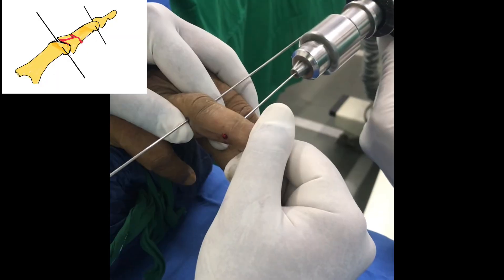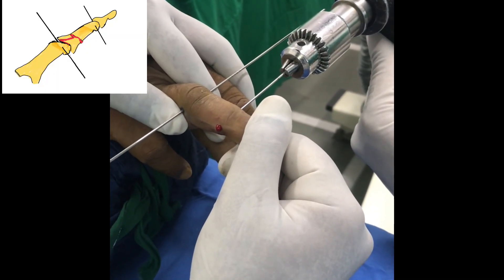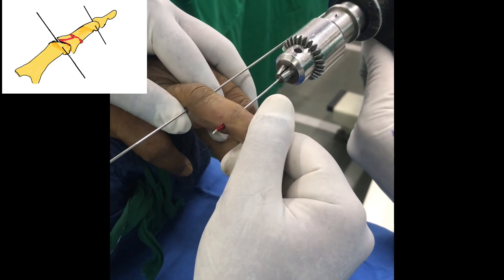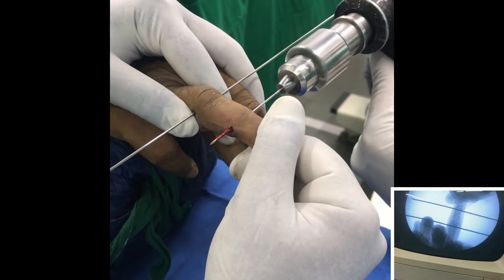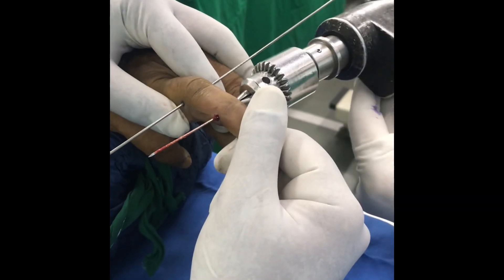Sharp ends are cut. Another wire is passed across the center of rotation of the distal interphalangeal joint. The two wires are passed in such a way that they are parallel to each other.